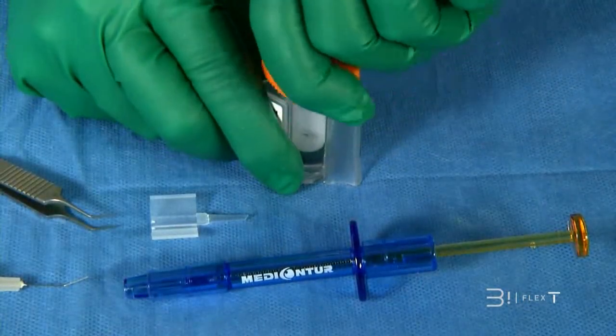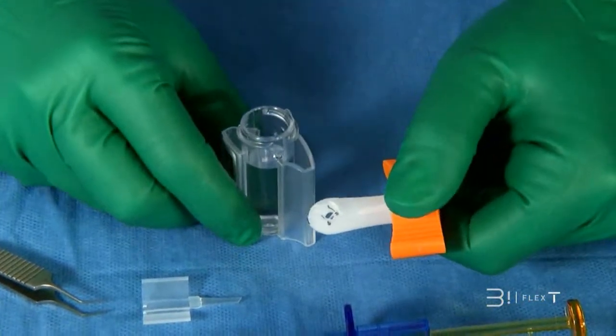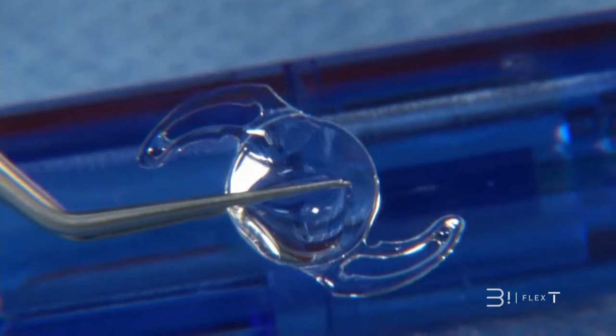Unscrew the stopper of the flask. Carefully extract the top shaft supporting the implant. Delicately seize the biflex implant so as to preserve optic quality.